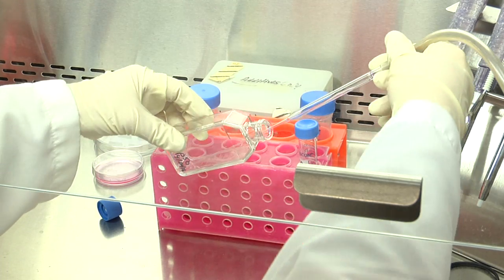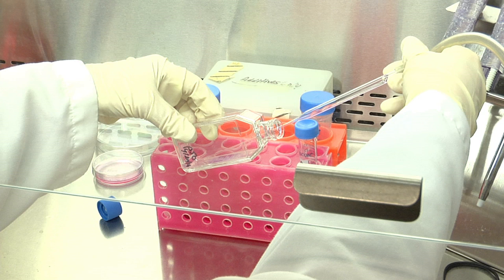This way, you should not damage the cells with the tip of the pipette. At the end of the process, the tip of the pipette should be all the way down the flask at one of its corners to make sure that all the medium has been aspirated.